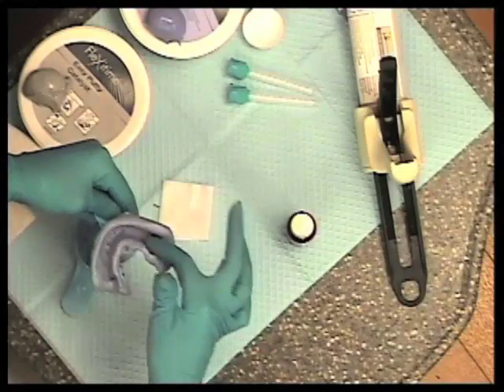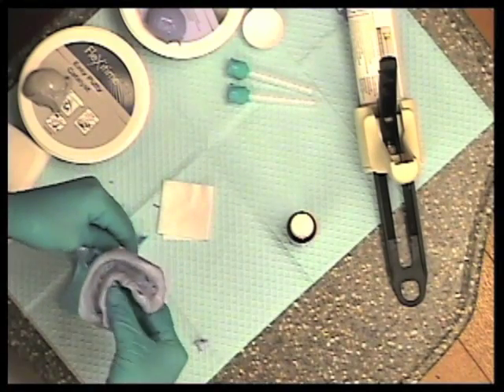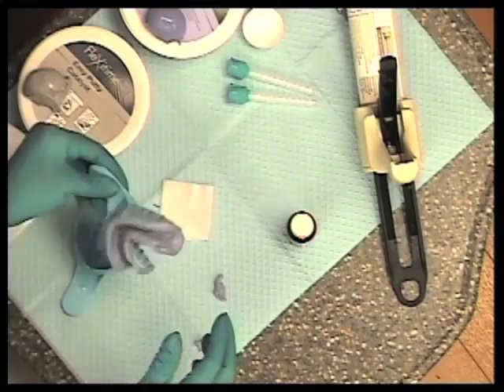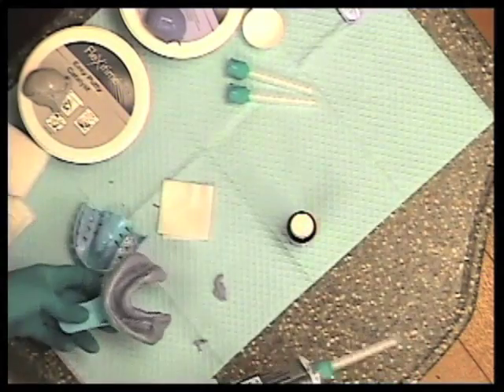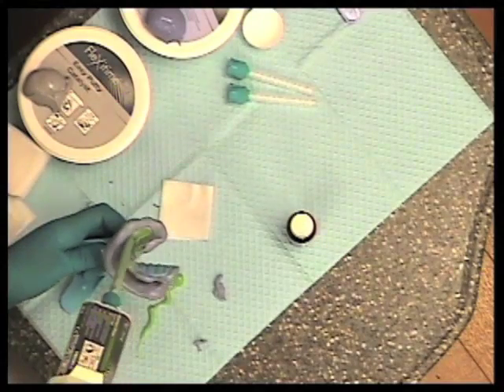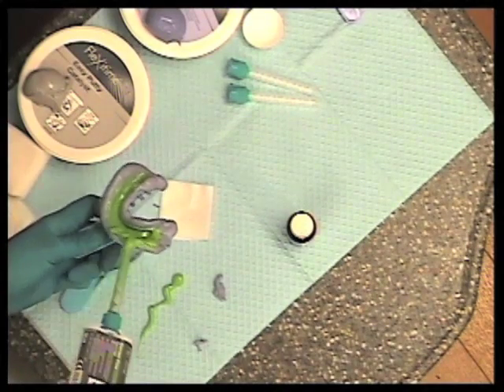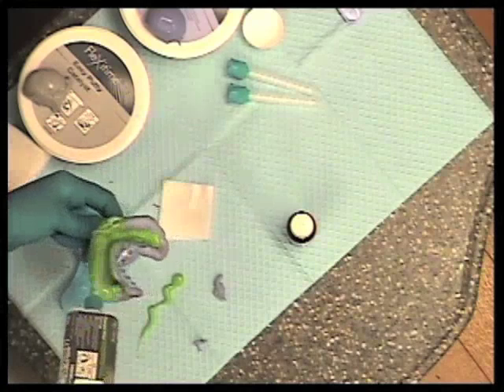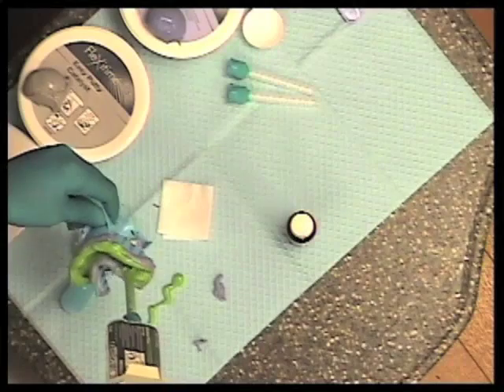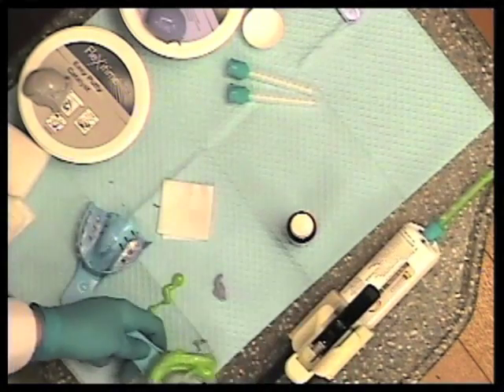Now what she likes to do first is just create a trough for where the teeth would be. She can also pinch this material if she feels that it hasn't been properly extended. But this is that customization that works so nice, because you're literally creating just a little custom tray for our preliminary impression. So just the wash of polyvinyl material goes in. Notice how she's getting it around the land areas. Got lots of working time here, so we don't have to panic.